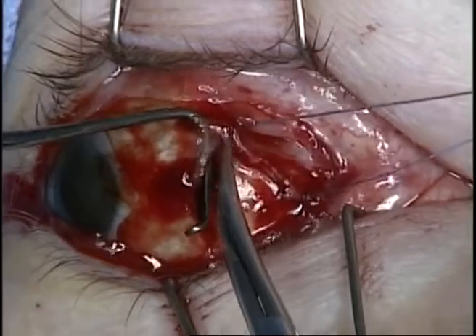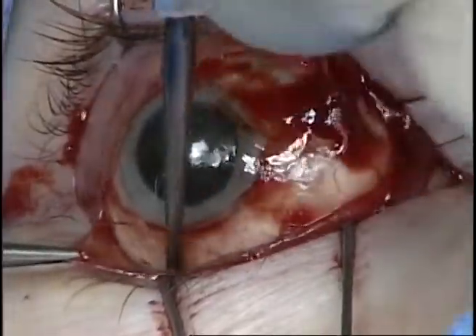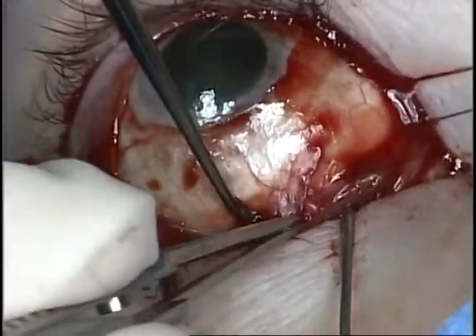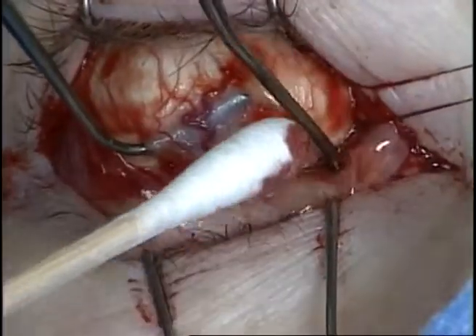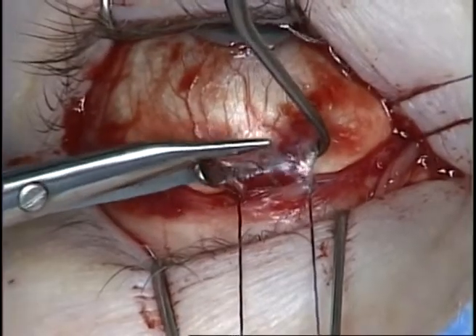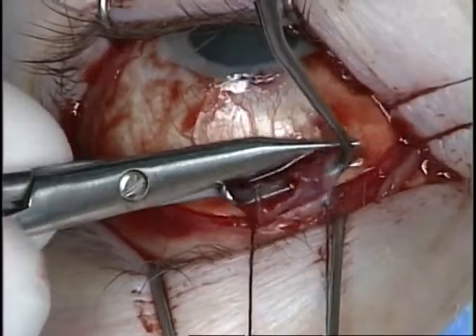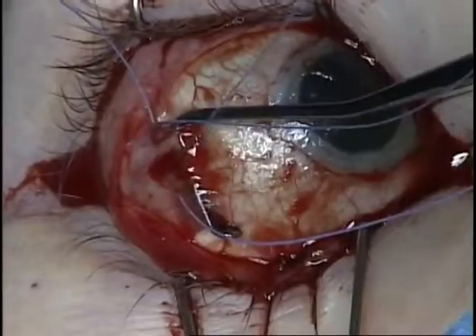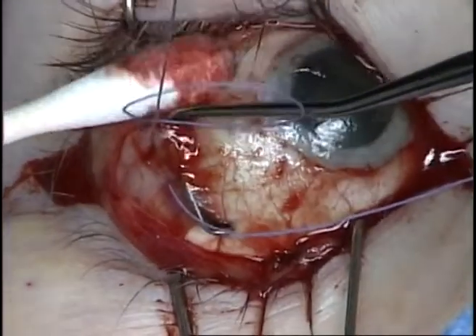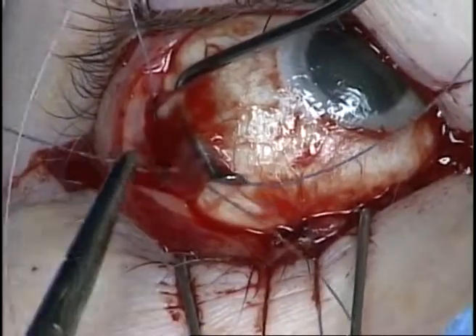The lateral rectus muscle is then hooked, tagged with a 5-0 Vicryl suture in a locking fashion, and disinserted from the globe leaving a small stump for future traction suture placement.